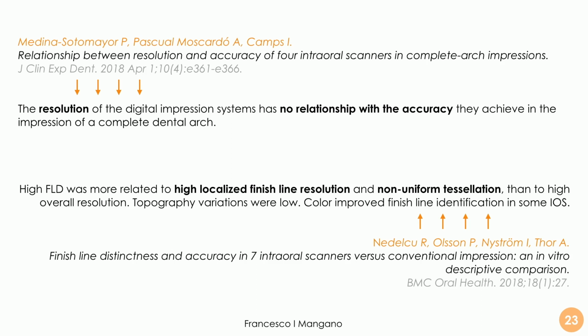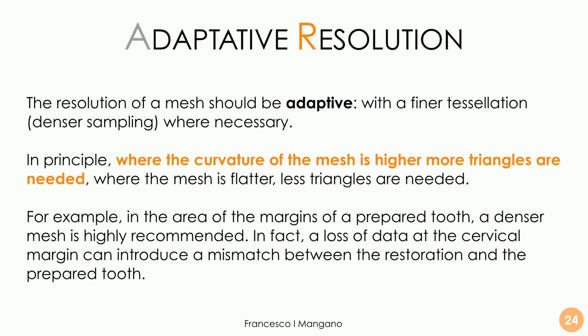In some software, we can also have the possibility to save the output into a polygon format that is an STL plus color, and this is not a real color, but it can help a little bit the dental technician. So once again, the concept of adaptive resolution is important.